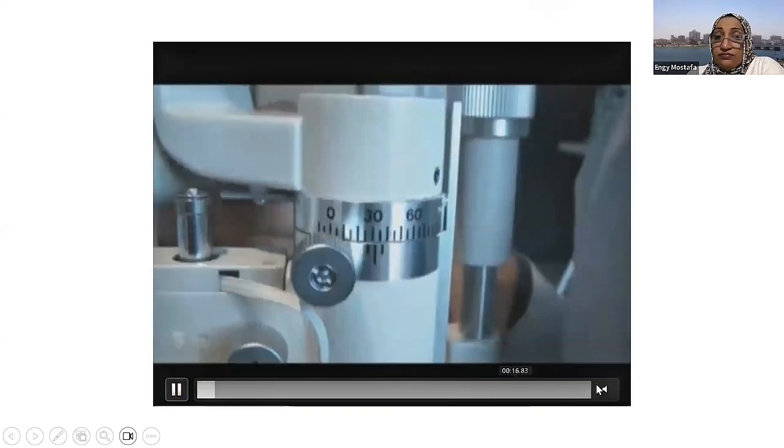So first of all, you need to shorten the beam, put it on the pupil, and sometimes you can dilate the pupil to make it more obvious if it's not visible. And if you're really suspecting some uveitis, especially after cataract extraction, you need to thin the beam, dim the lights, put it on the pupil, and then increase the magnification and look for these moving particles, which can take your prognosis and diagnosis to a new level.